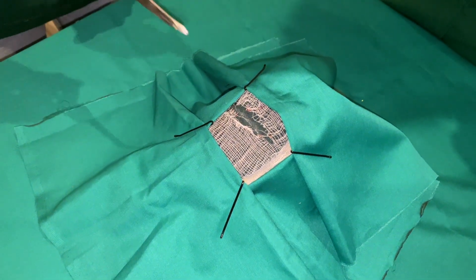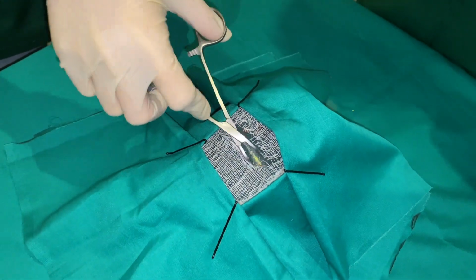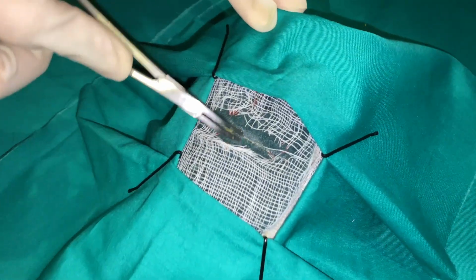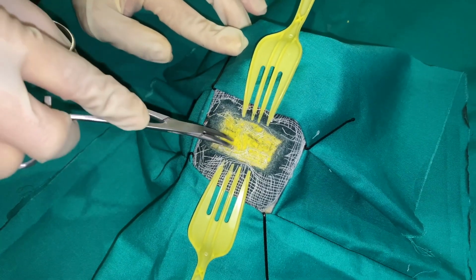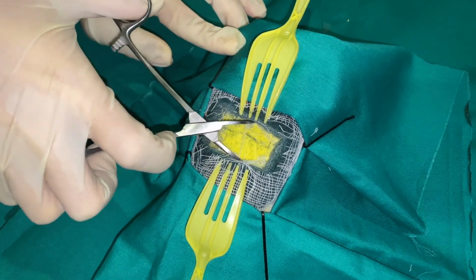Extend the incision through the skin, the subcutaneous tissue, and the platysma. Take care not to transect the anterior jugular veins. Dissect the trachea by parting the tissues. Remain strictly in the midline in a vertical plane to avoid injury to the inferior thyroid veins.